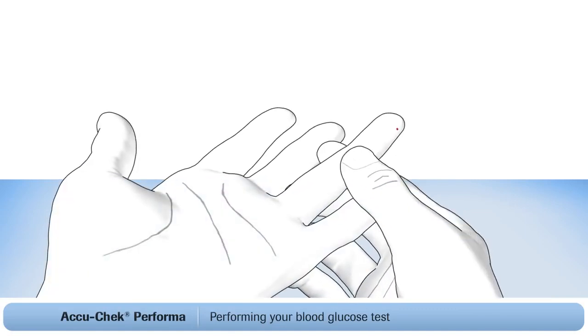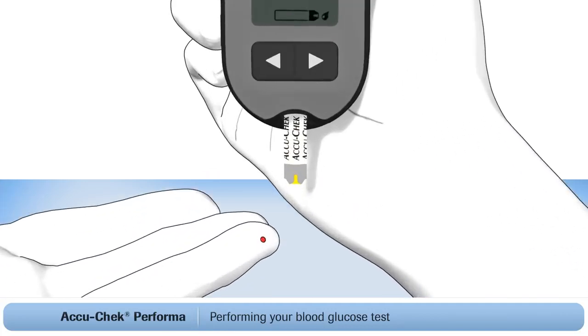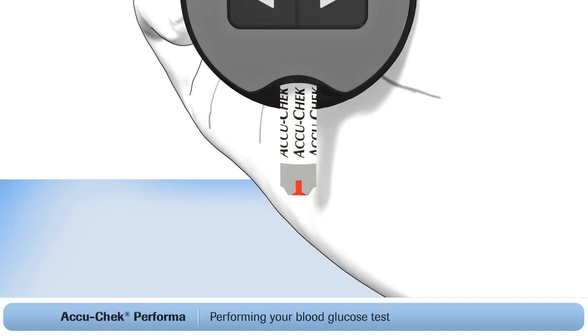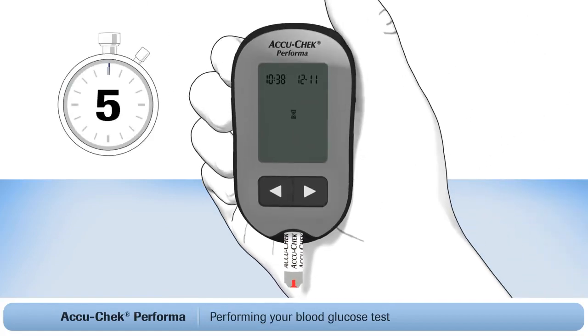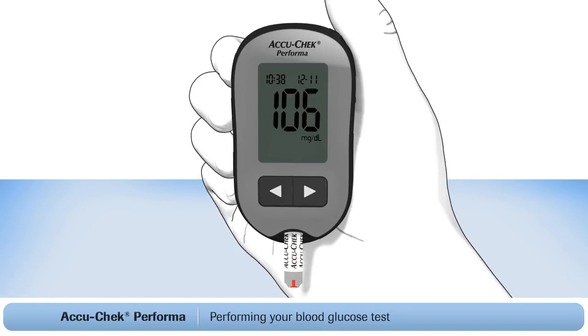Massage the finger in the direction of the fingertip to help the blood drop form. Now place the end of the test strip against the drop of blood and let it fill. When enough blood has filled the strip, a small hourglass symbol will flash on the screen to show you that the meter is working. Your blood sugar reading will be ready in 5 seconds. It's just that easy. Now you have your test result.